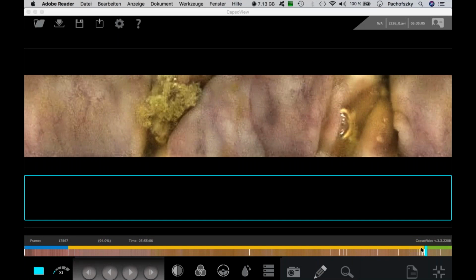I have some colleagues, they have seen 50 cases and they will never learn it, but they also will never learn it with an EndView system. And I have other colleagues who have, after 5 cases, really a brilliant work. So I would say between 10 and 20 cases, and then you will be perfect with this software and also with this totally new view to the mucosa.